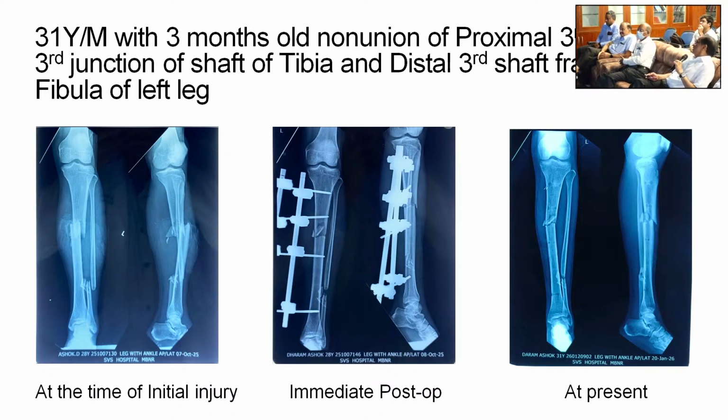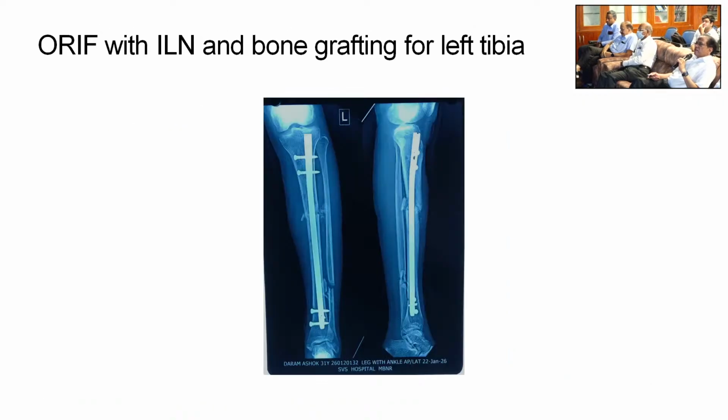This kind of ex-fix, I think probably, so better, don't wait. Wait till the wound is healed. Don't wait 3 months. As Dr. Anjali said, you can't expect the fractures to unite with this kind of fixator, unless it is Ortho-fix or Ilizarov. Okay.